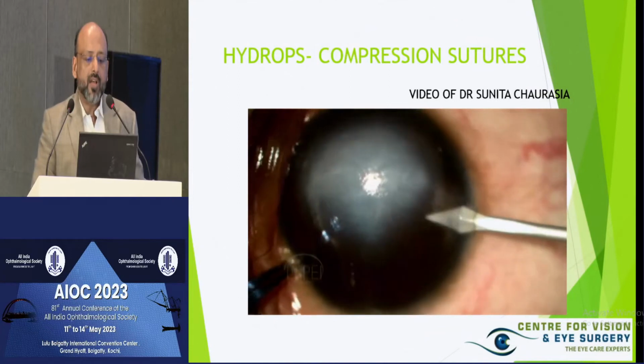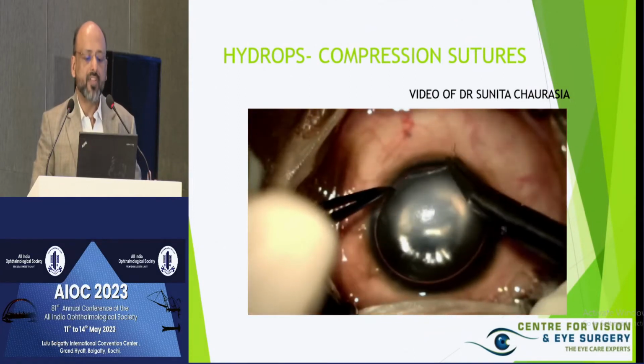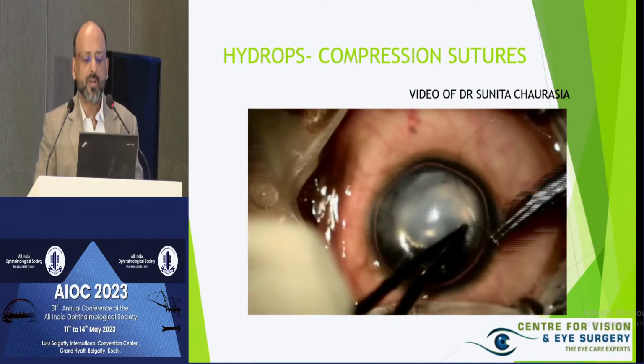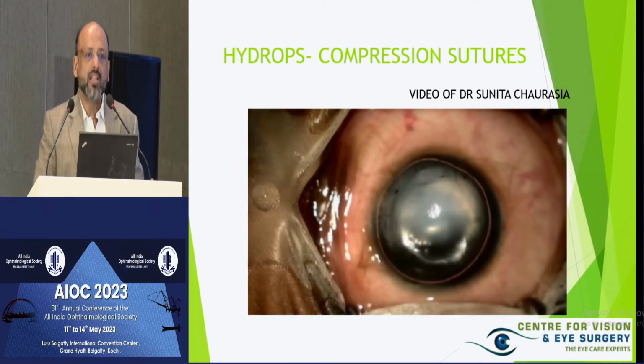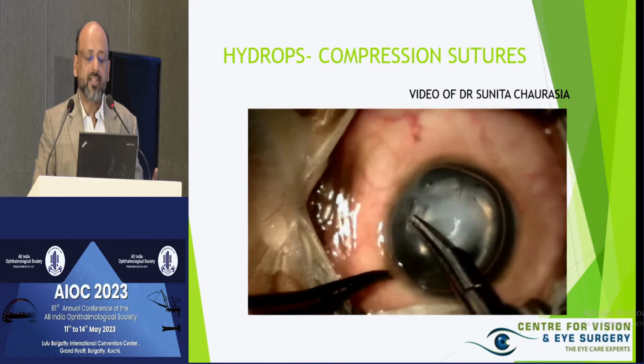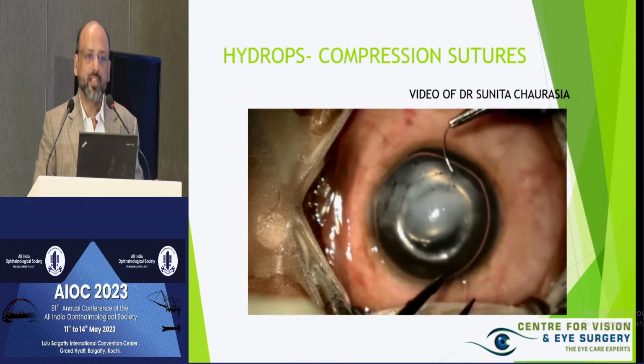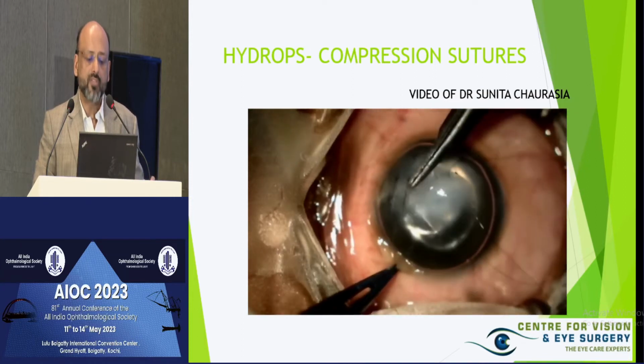Now, in hydrops, when you have significant amount of edema, Dr. Chaurasia described continuous compression sutures, which actually works well. The concept is basically to squeeze out all the fluid from the interface. You can take full thickness sutures as well. Avoid, of course, the visual axis.